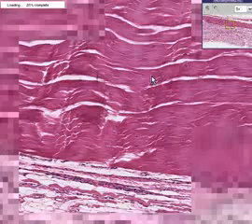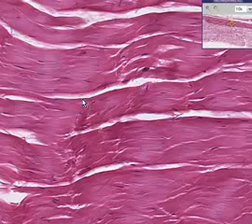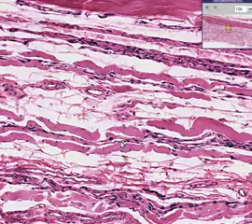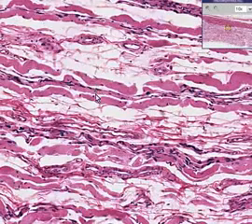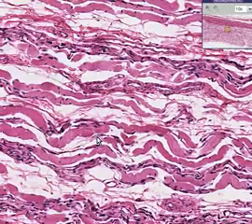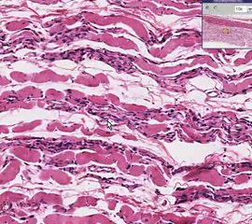Notice that in the top we still have some fibers in which, perhaps it's a hard time to see the striations. They're not really normal. But now in the bottom, we're looking at skeletal muscle fibers that are no longer straight. They're a little bit wrinkly. They're thinner than they should be. Sure, the nuclei are still at the periphery, like you see here and here and here and here. But basically, this skeletal muscle is being replaced slowly by fat. This is classic for atrophy of muscle, the most overwhelming cause of which is de-innervation.